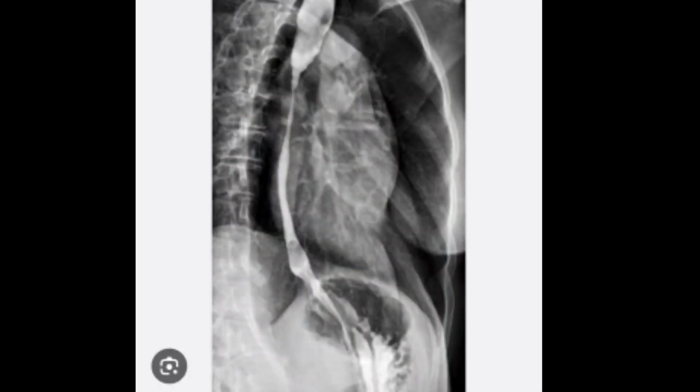This is the barium study, and here you can see that the contrast is clearly outlining the esophagus. On the top, the proximal esophagus, or cervical esophagus, or upper mediastinal esophagus, is clearly outlined without any evidence of stricture.